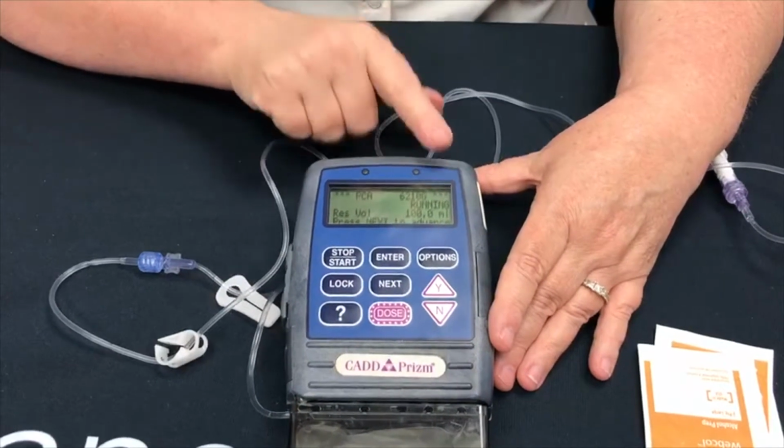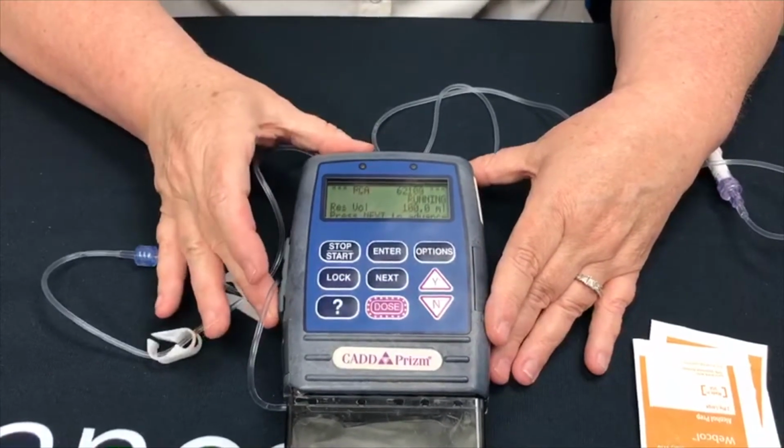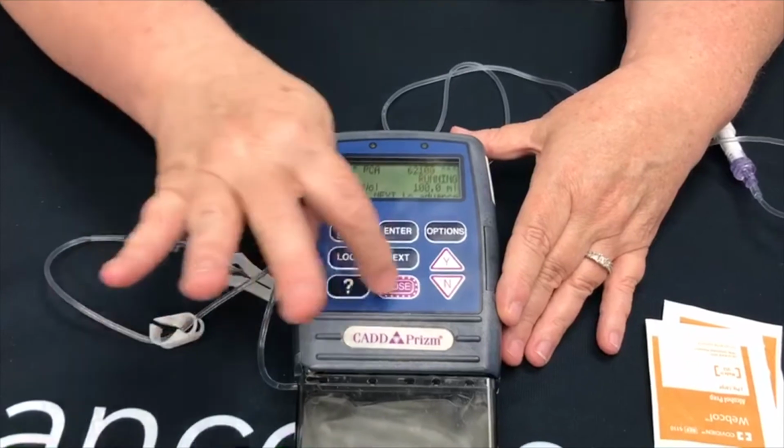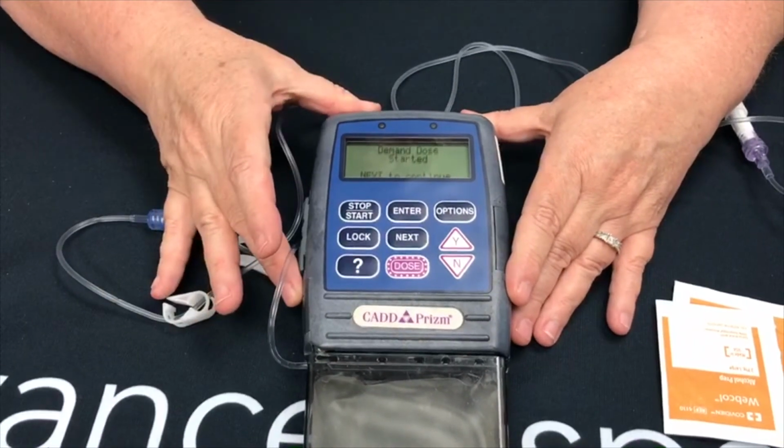Now it is running. We're in pain pump mode. And anytime you want to give yourself a dose, you will press the dose button and hold it down, and it will give you a dose.